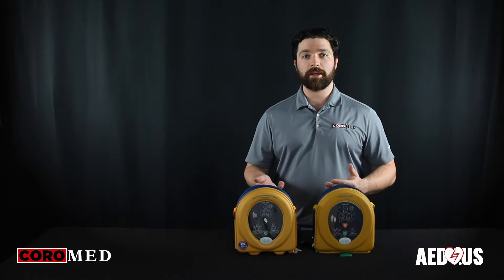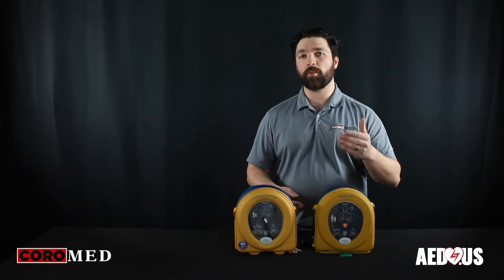Now, both devices offer CPR coaching, which means as you take it out of the package, it will turn on and start telling you what to do.